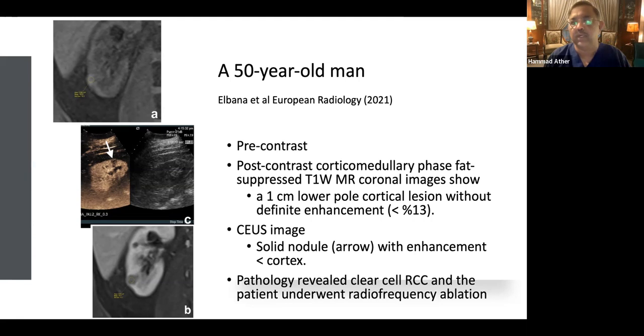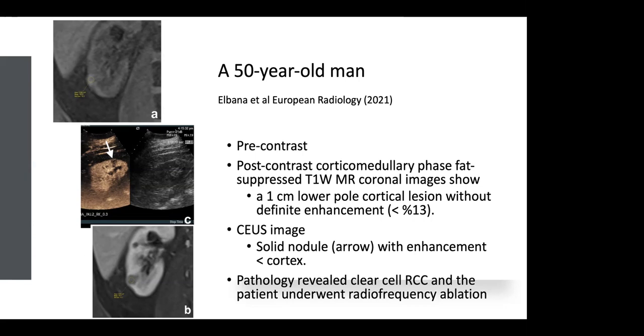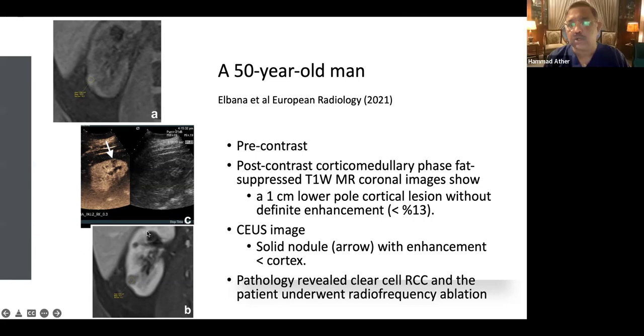Any finer points, Basit, before I proceed to the next case? No, you can continue. Good. So feel free to please stop me and add anything if I'm technically incorrect in pointing out these sophisticated scans.